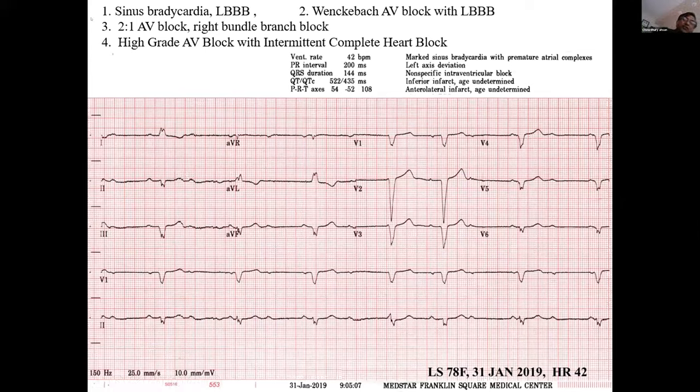Rohit bhai, it's very interesting, the previous EKG, how you look at it and how I look at it. I usually look at this as profound bradycardia, and then ask whether the ventricular mechanism is narrow or wide. And then I look for the relationship with the P wave.